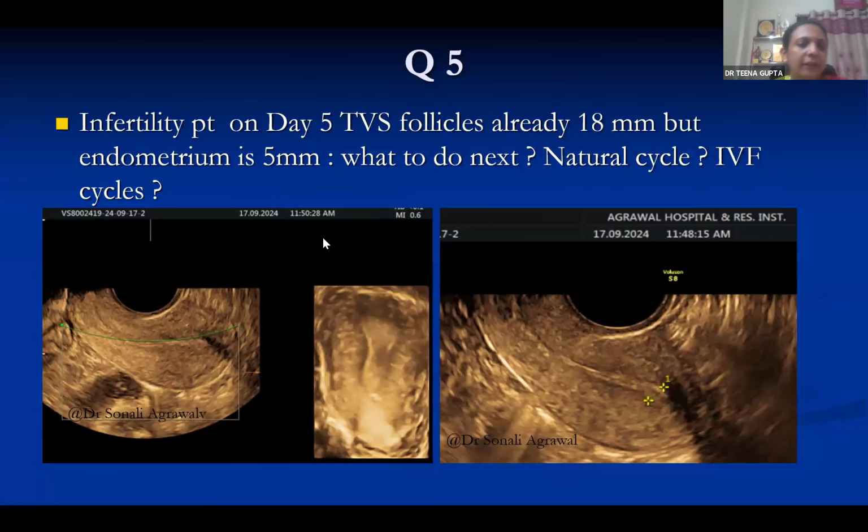And I would just like to add one more point here. Yes, Doctor, small polyps are sometimes seen on day 2 just as thick endometrium. We are not able to find the proper delineation. But as we continue the follicular scanning, these polyps become more prominent. On day 2, they just appear as thick ET. So we should always keep in mind, in patients with thick endometrium and no ovarian cyst, it can be an endometrial polyp also, small polyps.